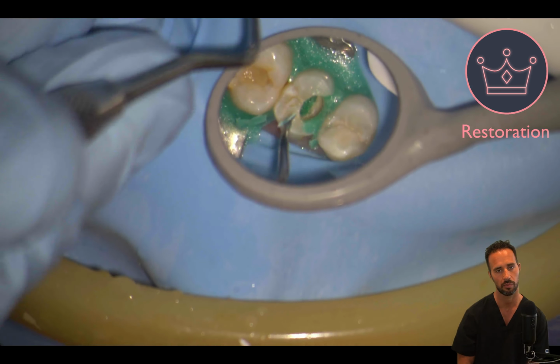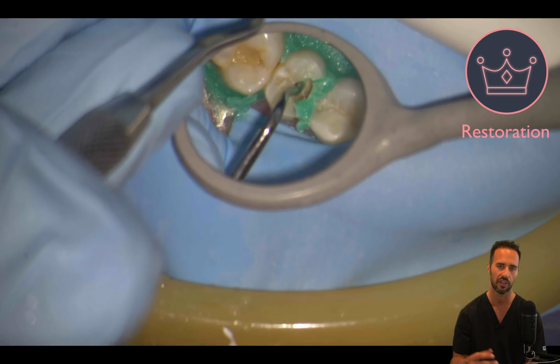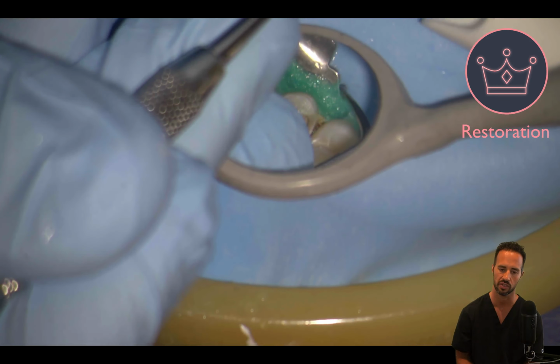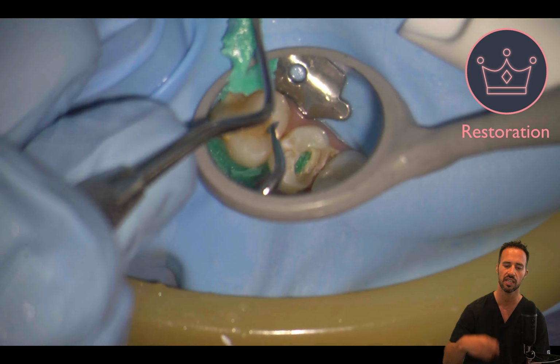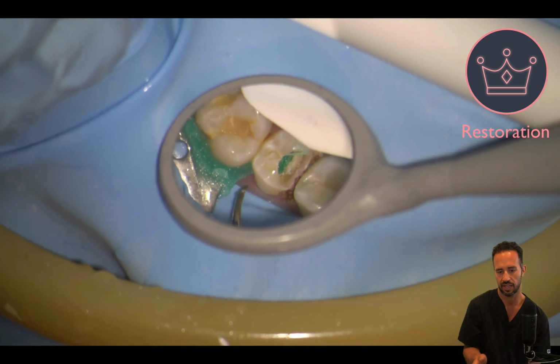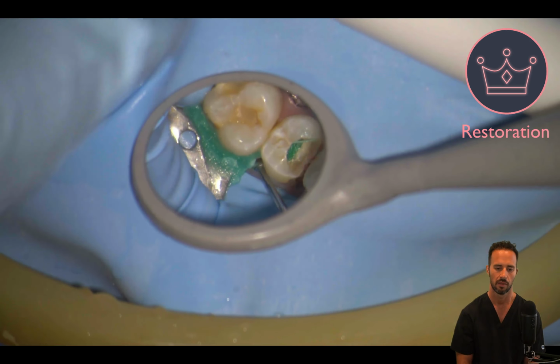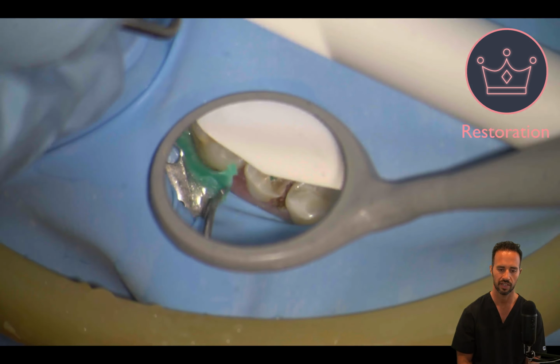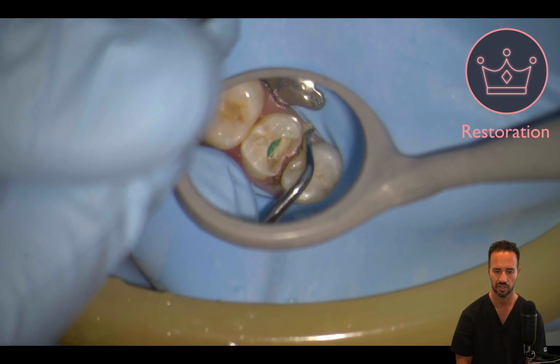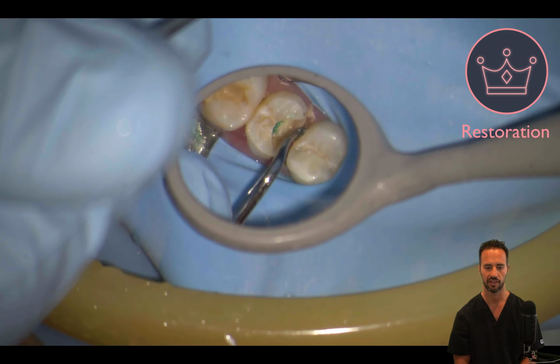You can restore just with the rubber dam on because you have this split dam isolation. You have the room to work. You may not be able to fine tune your occlusion, obviously, with the rubber dam on, but you can do the majority of your restoration. And I use the spoon excavator to remove that opal dam green just by getting under there and kind of flaking it right off. Be careful to not flip off the rubber dam clamp. That can happen. And there's a little unsupported enamel there that I'm just cleaning up, but you get the idea.